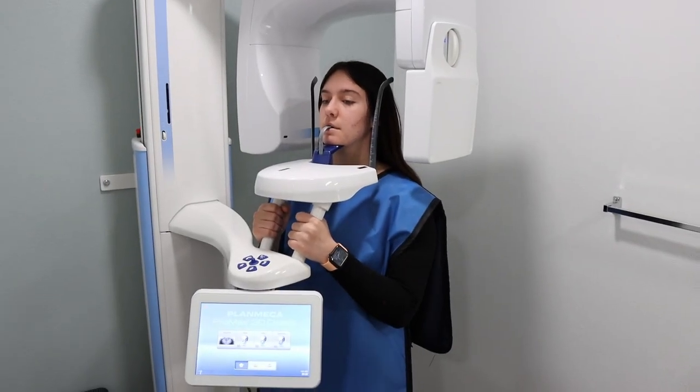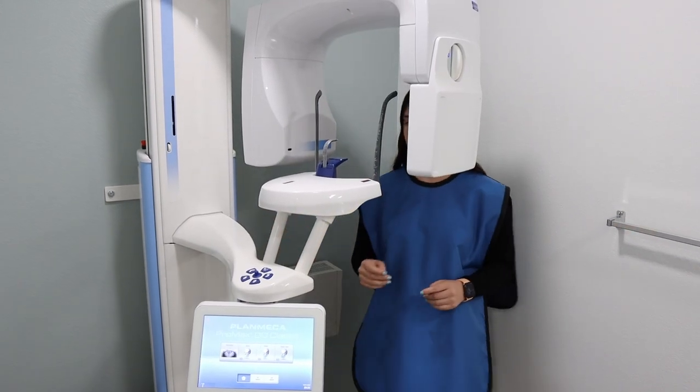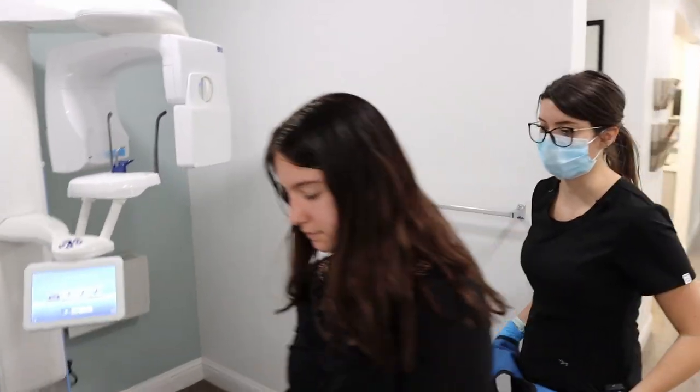When the pano is complete, you'll instruct the patient to step toward you. You'll remove the poncho and instruct the patient to return back to the same operatory they were in.